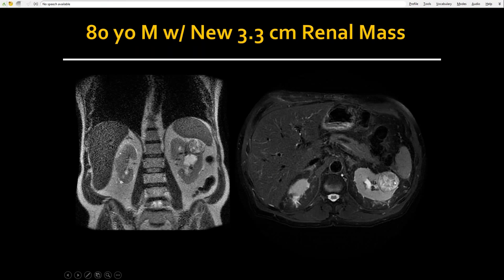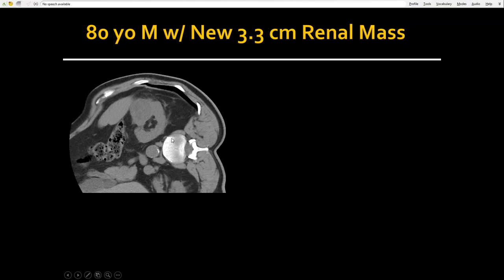You can see here this tumor. It's about 3 centimeters or so, maybe 3.5 centimeters, along the mid to upper aspect of the kidney. But what's unique, and what you have to keep in mind, is how you're going to approach this thing, and what's going to be adjacent to your probe. So first thing is we put this patient right side down, and you can see that the lung's in the way. So now you have to come up with how we're going to treat this tumor, because you're not going to want to go through lung in order to treat it, and you can't go through the spleen in order to treat it.